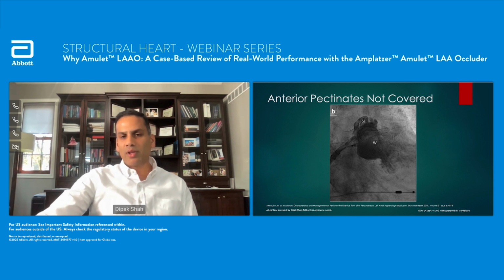Any more proximal, you're going to have a huge shoulder, and they already have a mitral shoulder, as you can see from here. So you're worried about stability, you're worried about your shoulder. Usually you see this on angiography as kind of like a comb, like these little strand-like structures, and you can see this here that's left behind.